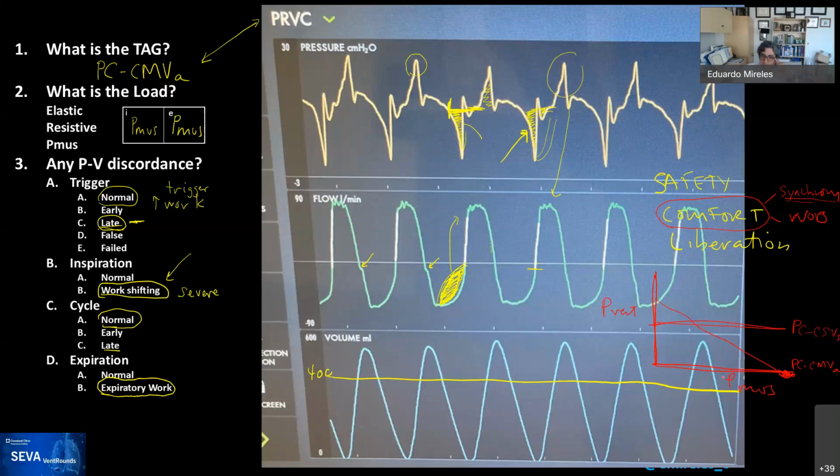And what you would do is move up and down the amount of pressure support from the ventilator to offload the pressure from the patient, or maintain a work of breathing from some constant support from the ventilator in relation to the patient, to support him if that is inappropriate for them, so that they don't use more of their cardiac output going to the respiratory muscles if they're acidotic, or if they're anxious, and they have more support in what they're getting.